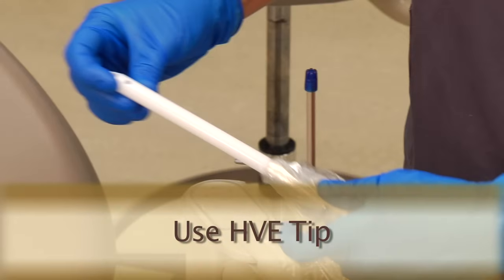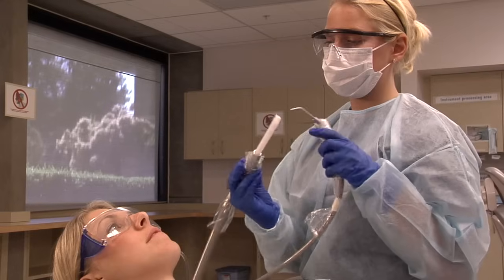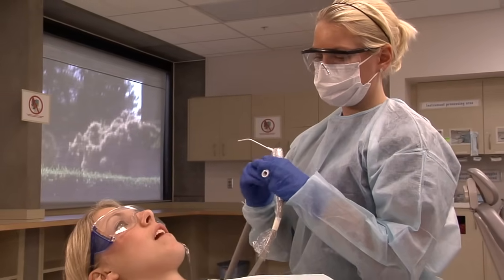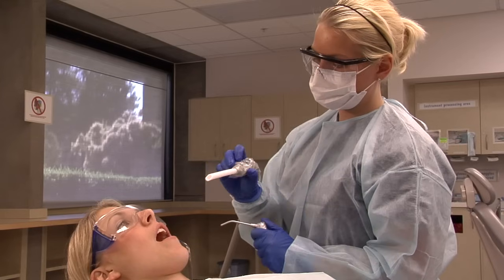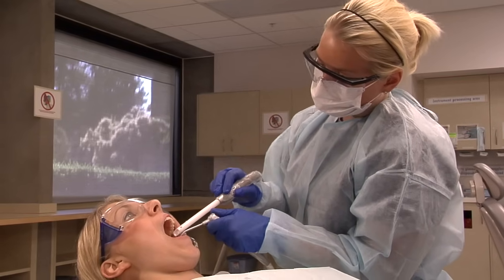Next, the assistant will use the HVE tip to suction water from the patient's mouth in the posterior area. Holding the HVE suction device in the right hand using a pen grasp, make sure the bevel and switch are facing up so the switch can be turned on and off using the right index finger.